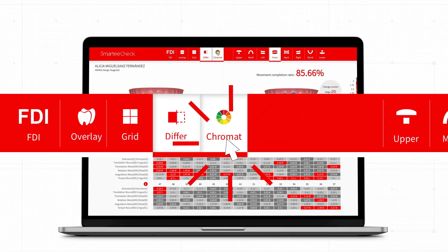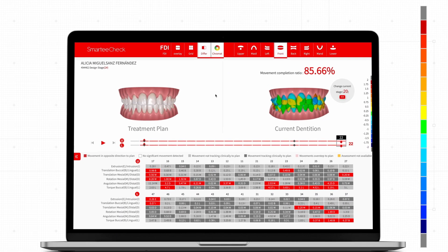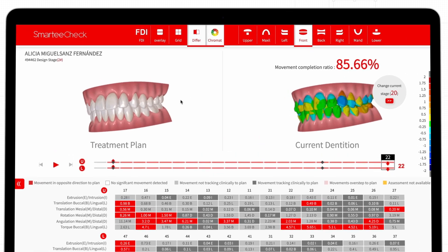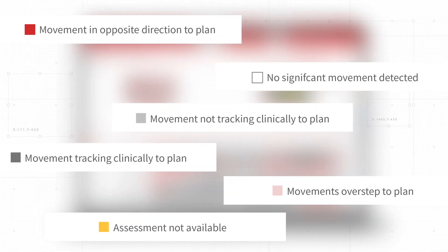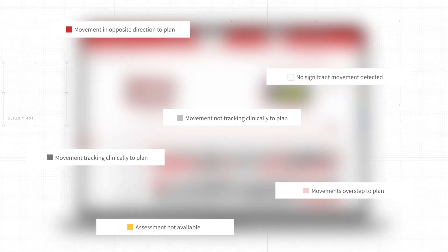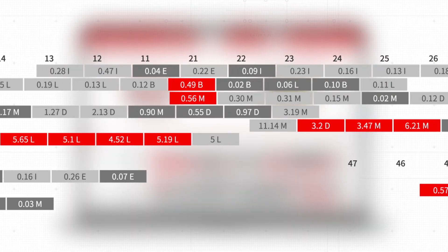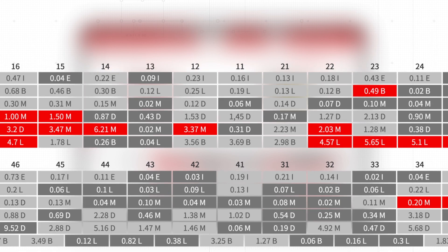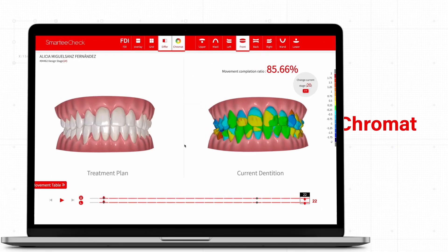The movement table shows the exact movement amount and direction of each tooth. In only seconds, previous treatment completion ratio and teeth movement data can be generated alongside additional analysis from Chromat Movement Tracking Indicators.